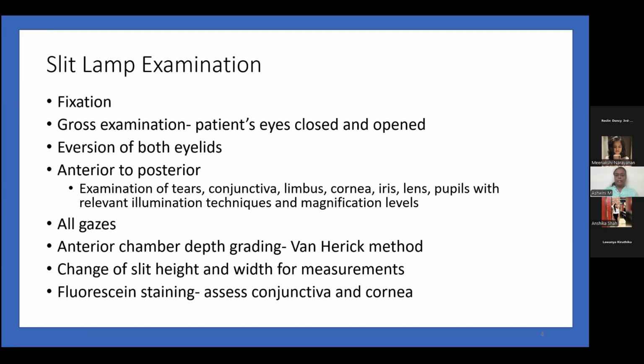So when you do slit lamp examination, Ms. Reslin gave a very elaborate and very good explanation about what all has to be done. Just to add a few points, ensure that we give a fixation to the patient. Otherwise, patients will tend to keep moving their eyes here and there without knowing where to see. So it's very important to give the fixation.